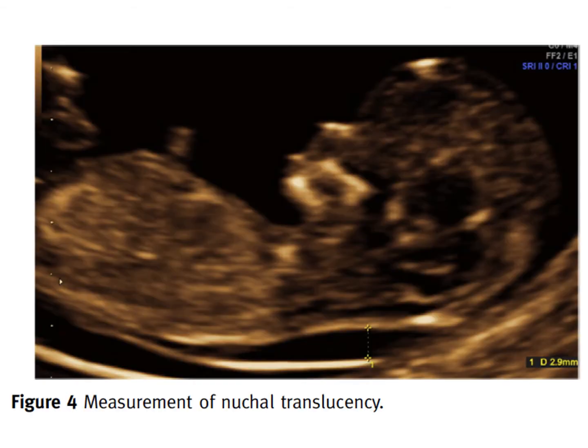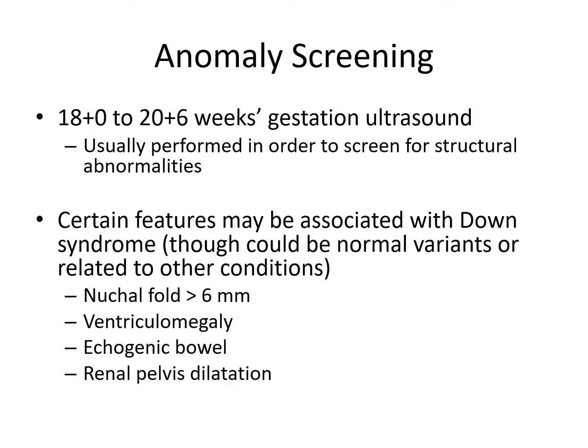Here is an example of nuchal translucency measurement. Looking at the fetus from the side, we can see the head, and behind the neck is a translucent space related to lymphatic development. This space tends to be thicker in Down syndrome and other aneuploidies. This particular slide shows a nuchal translucency of 2.9 millimeters. We use gestation-normalized charts rather than a single cutoff to interpret the measurement.